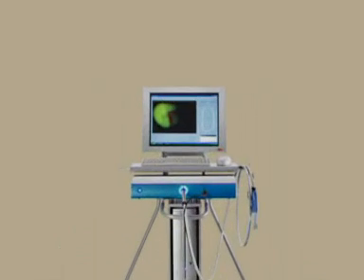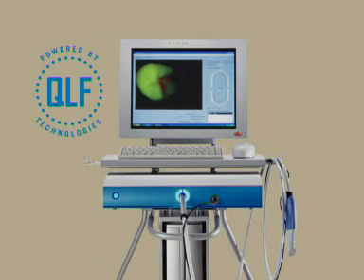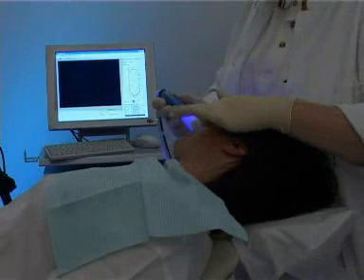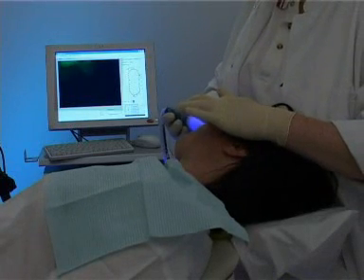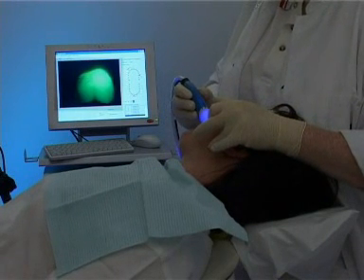Today we proudly present the Inspector Pro, the first FDA-approved instrument powered by QLF technology. The Inspector Pro system consists of an intraoral fluorescence camera and software that quantifies the fluorescence images.